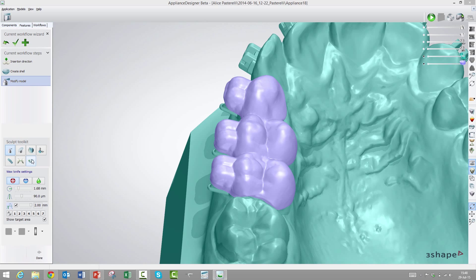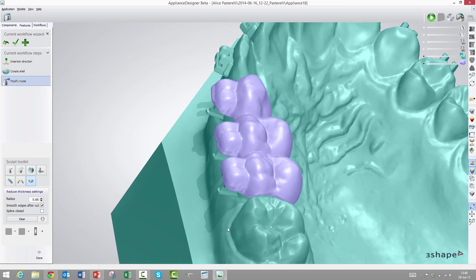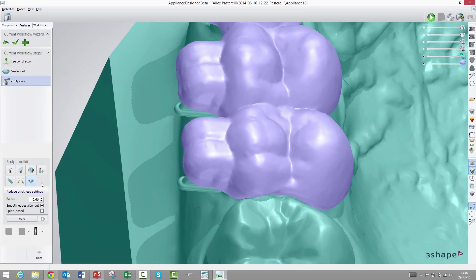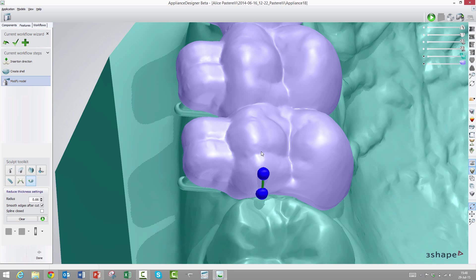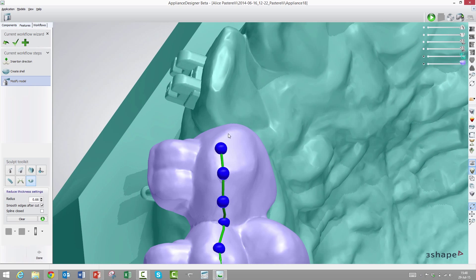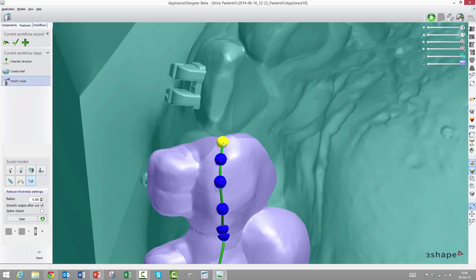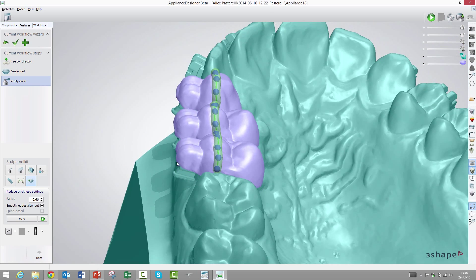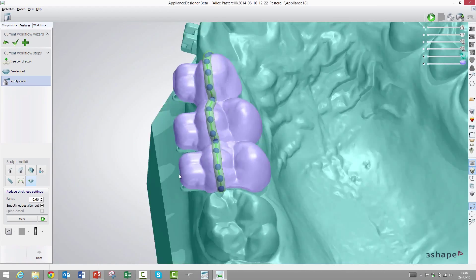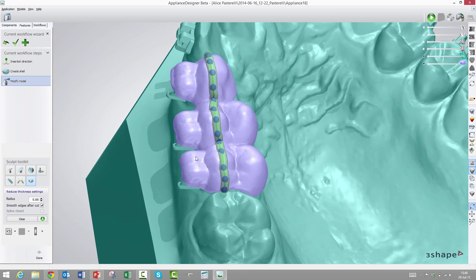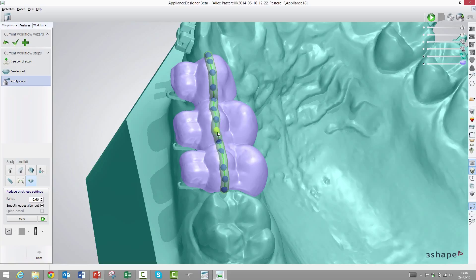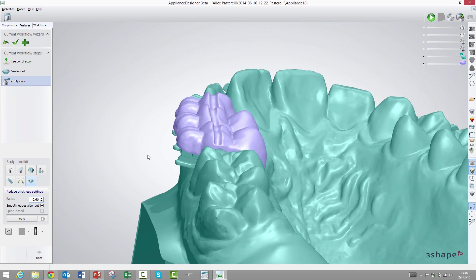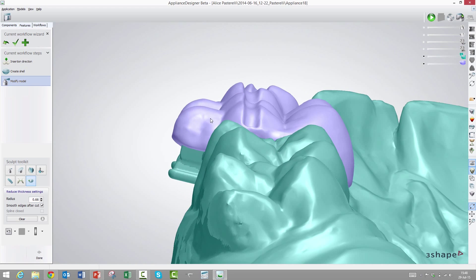If this material was a little too stiff, maybe we would like to make it more flexible. We have the possibility to do that. Click on the shell, then press modify model. We have a tool where we can make thinner areas on the shell so it will be able to flex around these edges. Choose reduce thickness to true, then simply click along the line where you want it to be thinner. Maybe along the incisal edge here.